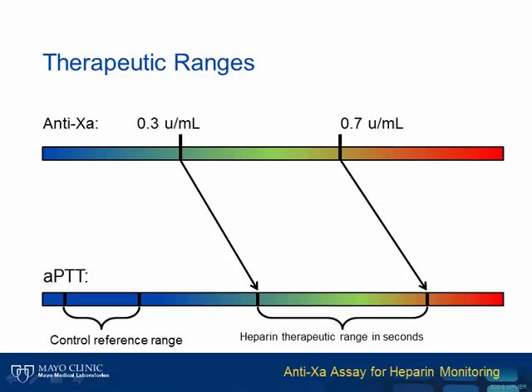CAP requires revalidation of the therapeutic ranges with each change in reagent lot or instrument, and validation requires obtaining ex vivo sampling from real patients on heparin therapy. As a consequence, laboratories must monitor lot changes and perform the difficult task of establishing new reference ranges regularly. The laboratory must identify patients for ex vivo testing by working with the clinical teams. Samples must be collected at the right time, and testing must be performed in a timely manner.